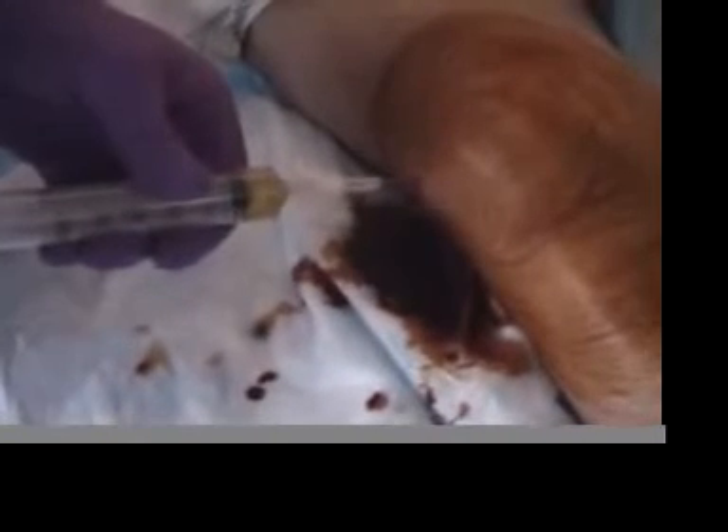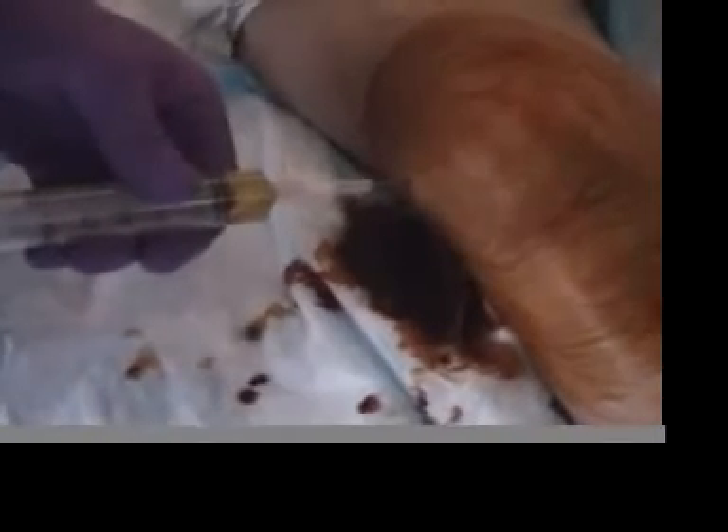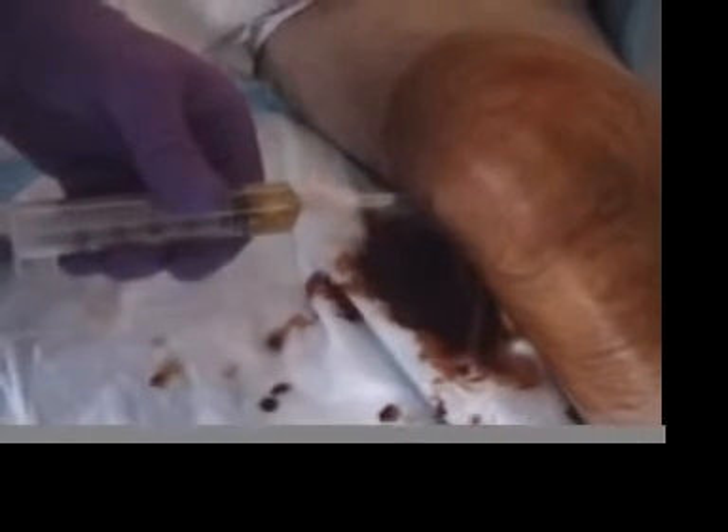When you have entered the joint space, you will aspirate a clear to straw-colored fluid. This is your effusion. Remove as much of the effusion as possible.